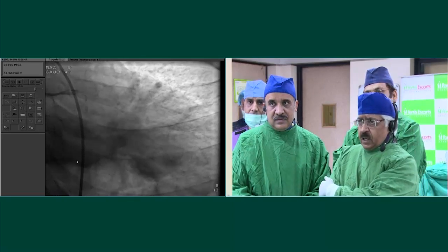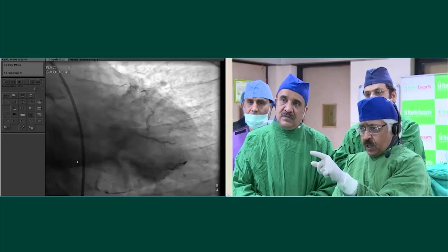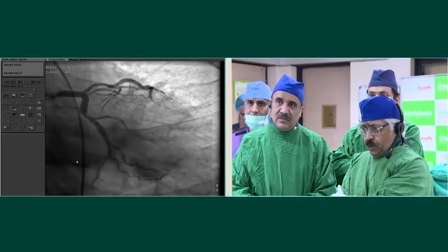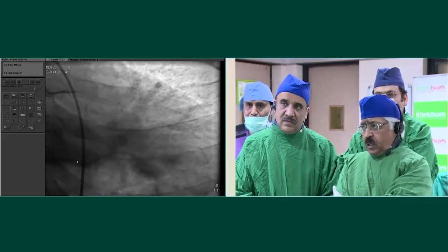You can see that the OM also flows slowly. Do you see that OM also flows slowly and sluggishly down? I guess he's got some microvasculature stuff, you know. Next.